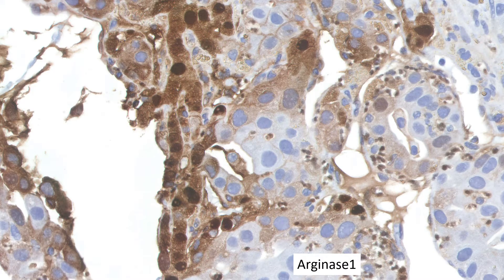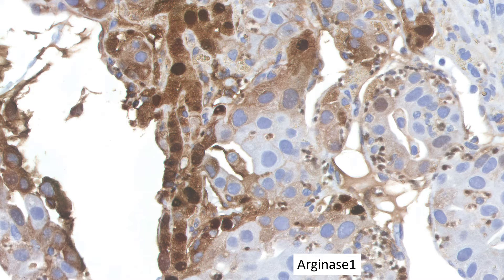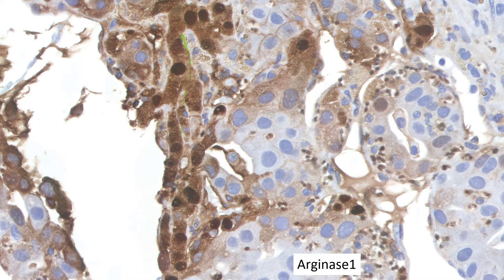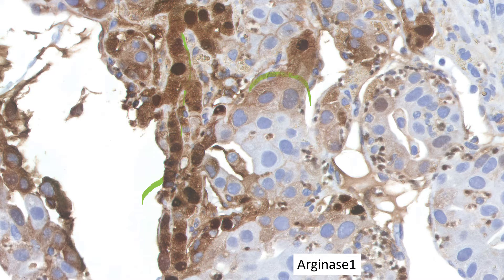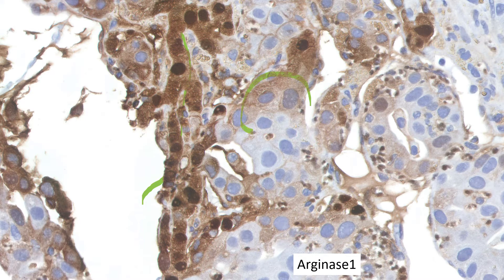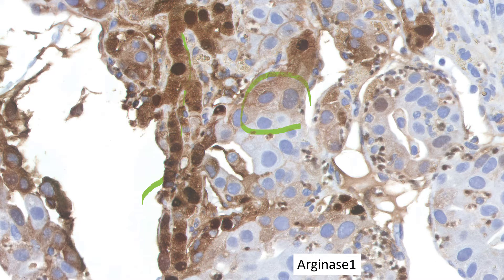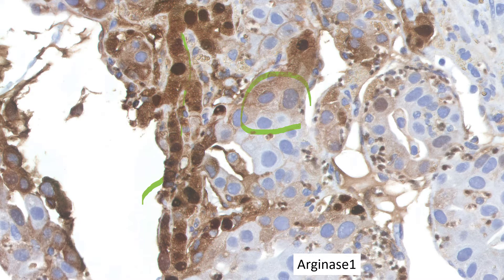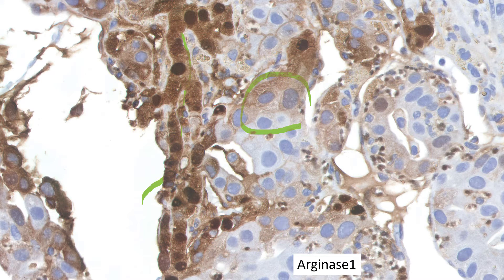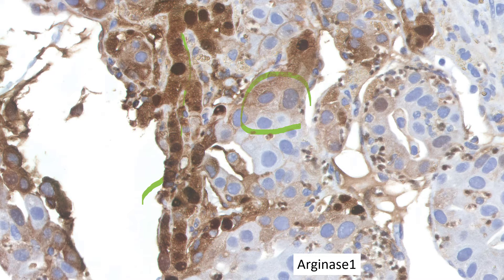Here's the arginase stain — this actually turns out to be entrapped liver, so watch for entrapped liver. But you can see the hepatocellular carcinoma is positive. As I mentioned in my previous talk, arginase is my go-to stain for a diagnosis of hepatocellular carcinoma. So this was not a metastatic adenocarcinoma but a gland-forming hepatocellular carcinoma.